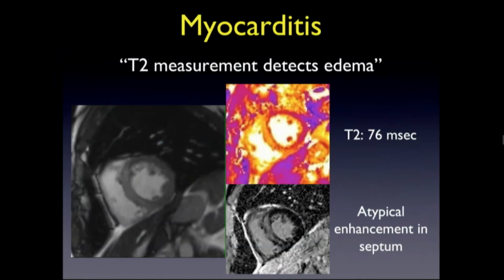So moving on to more of the quantitative imaging with MR. The first one I'll talk about is T2 mapping. So if you remember, our T2 measurement is used to calculate a T2 value, which is used as a surrogate for edema. Generally speaking, a T2 value above about 60 milliseconds is considered abnormal. Now there's a range in there, so 55 to 60, but for practical purposes, probably 60 is a good one to take.